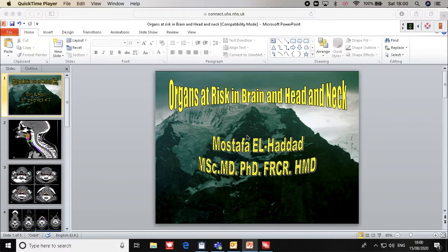So this lecture is for my junior colleagues, and please, all seniors, relax and stay away. This week is not for you; it's for my junior colleagues. We will go through how to delineate the organs at risk. It's clear that the guidelines are there. You can go through them. So I want you to try to go together.